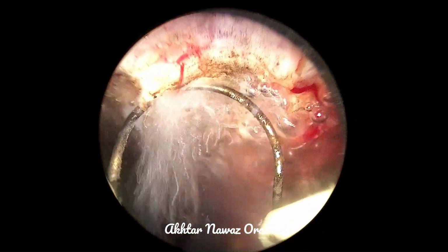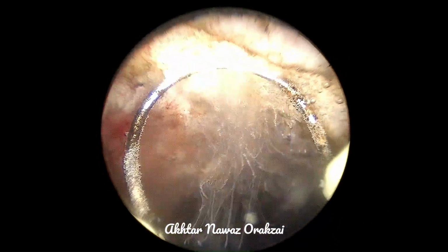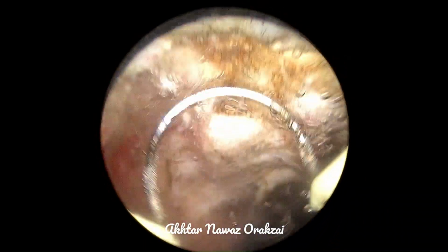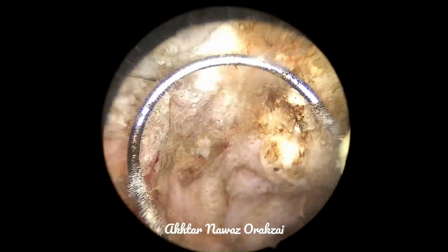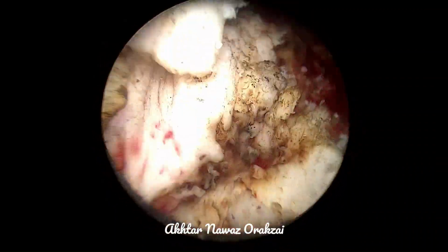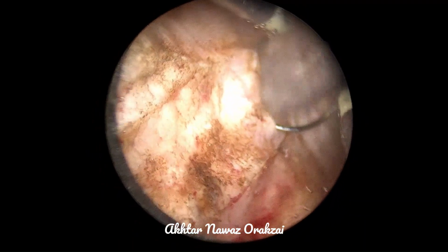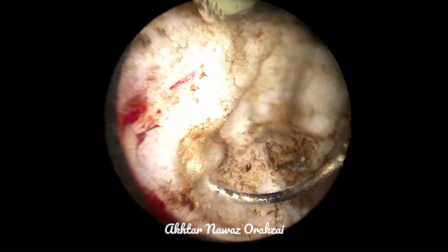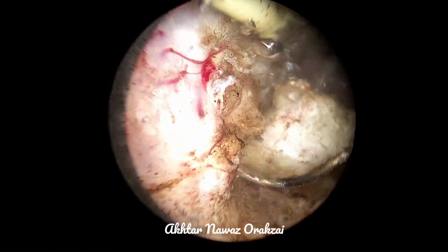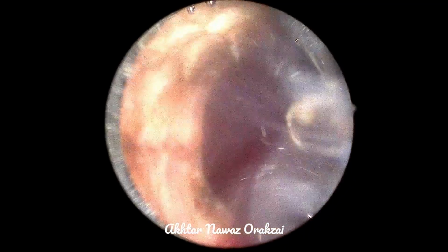Here you can see I am coming back towards the verumontanum, taking the flaps of the prostatic tissue into the prostatic cavity and then using the diathermy. We are coagulating thoroughly here just for educational purposes so that everything is visible to the students. Otherwise, there is no need to coagulate these small bleeders during the procedure, because the more you coagulate, the more time it takes.